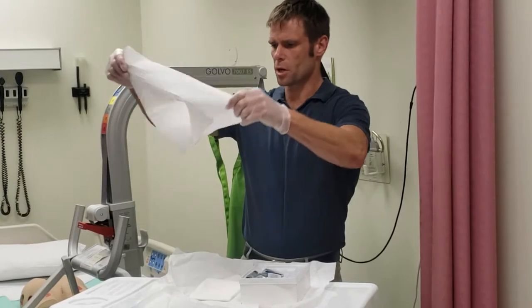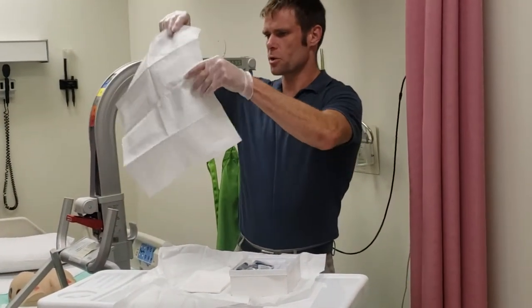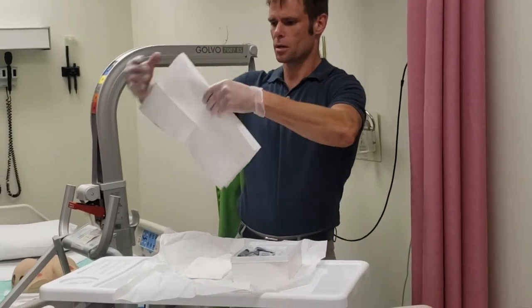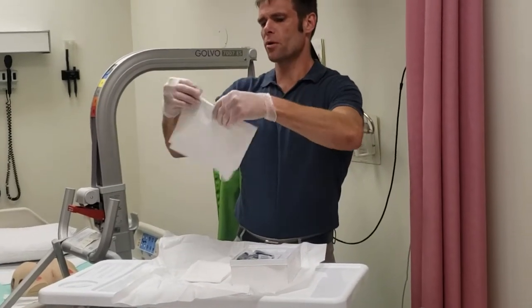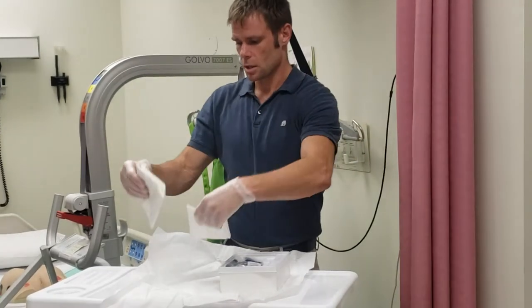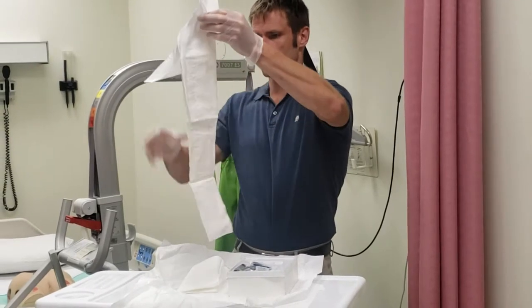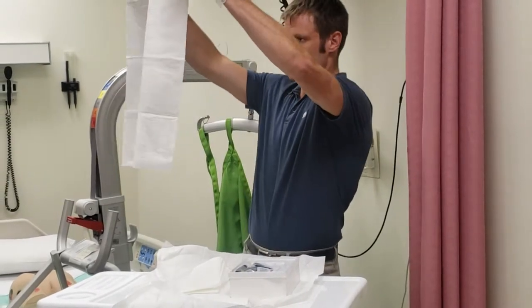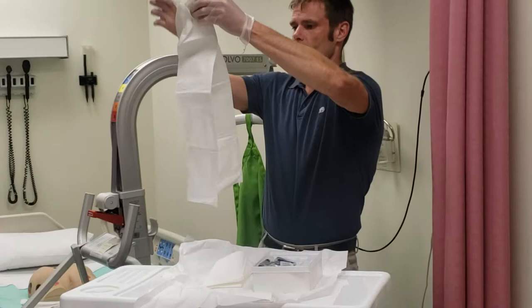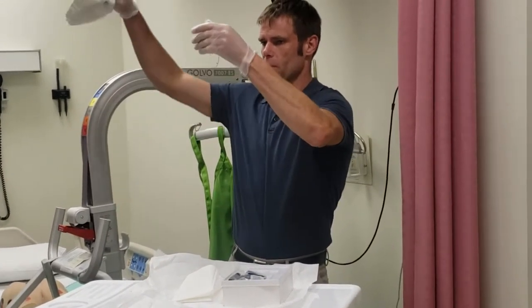There are a lot of different ways to drape your patient — it's up to you. For the female I use this drape, which is a non-fenestrated drape. The shiny side goes away from where the fluid is going to be — so you can't just say down or up; it depends on what you're doing. This other drape is what I call the fenestrated drape — it has a hole or a diamond in it. You can use that for the male, and I'll show you how to do the male catheter in a little bit.